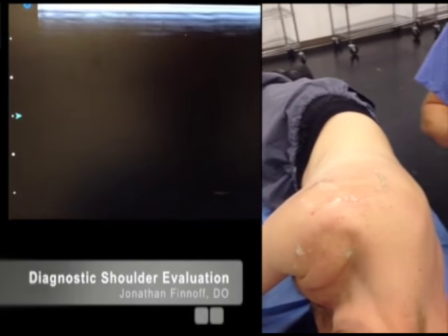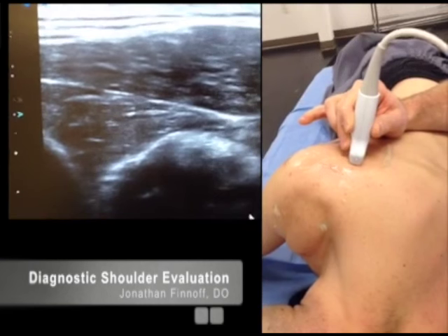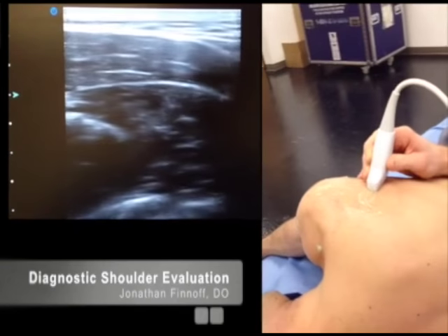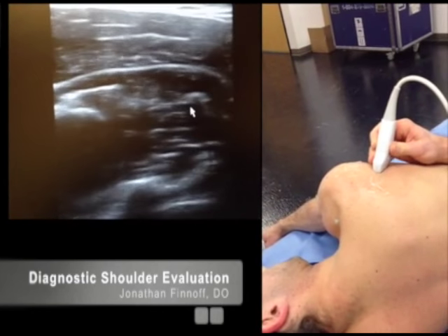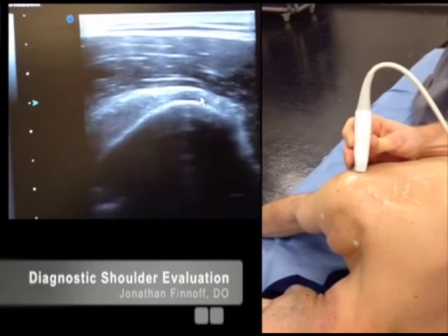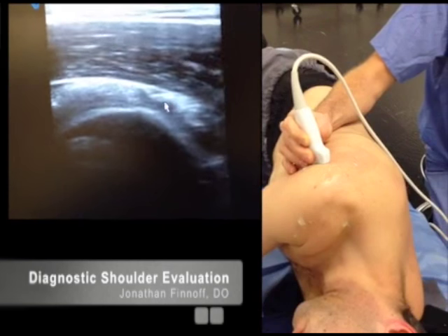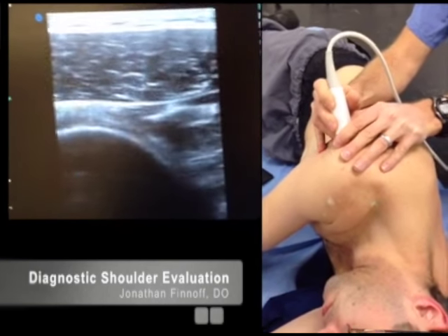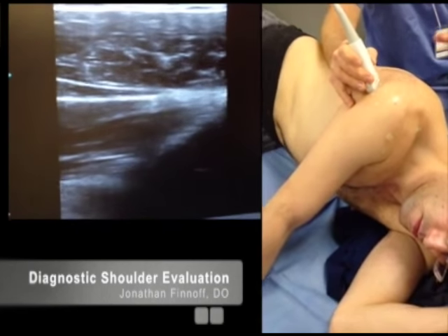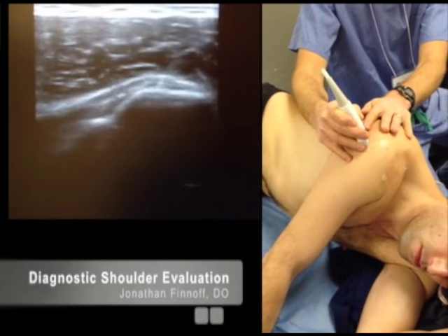After looking at the infraspinatus, I'm going to look at the teres minor. Cephalad is on the left-hand side of the screen, caudal is on the right. I'll increase depth to see the body of the scapula and go just a little bit caudal. Right here is the teres minor. I'll follow that teres minor tendon all the way out in short axis to its insertion on the inferior facet of the greater tuberosity. We can also look at that in long axis — rotating so lateral is on the right of the screen and medial on the left. There's the teres minor in long axis, and there's the insertion right there.